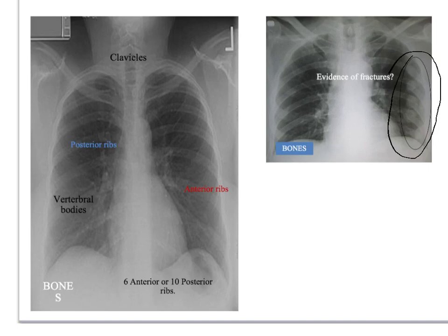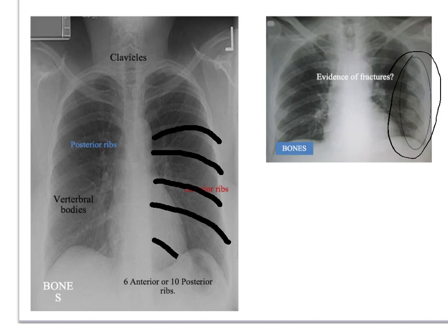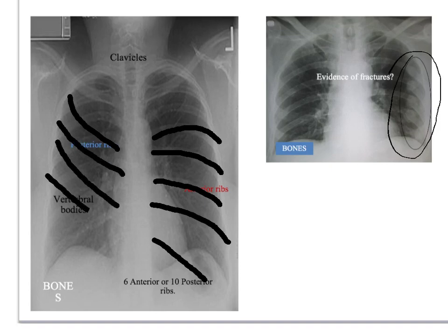Be aware of which ribs are which. The posterior ribs run along in one direction and you should see up to ten. The anterior ribs run in a slightly different direction and are harder to see, but you should be able to identify six. If you can see more than six anterior ribs, then the lung may be hyperexpanded.